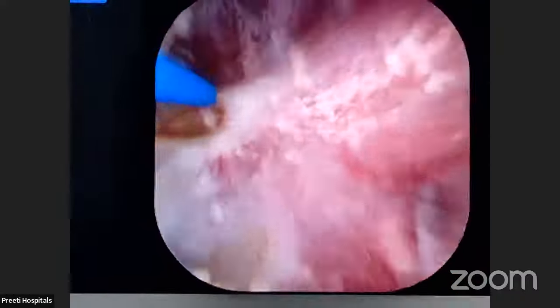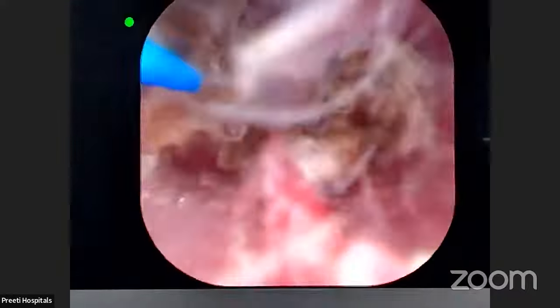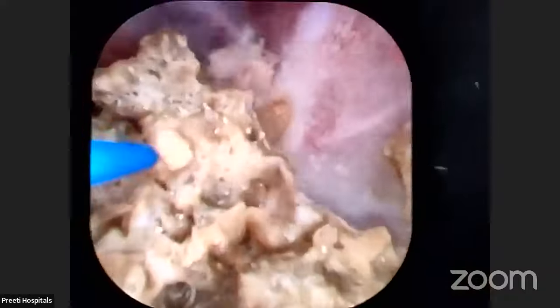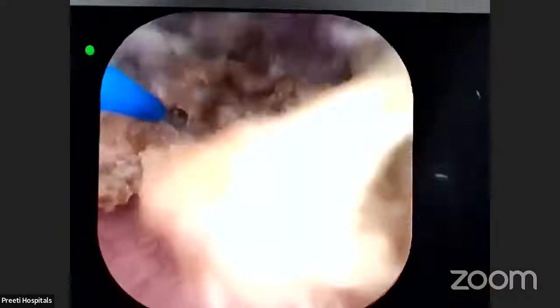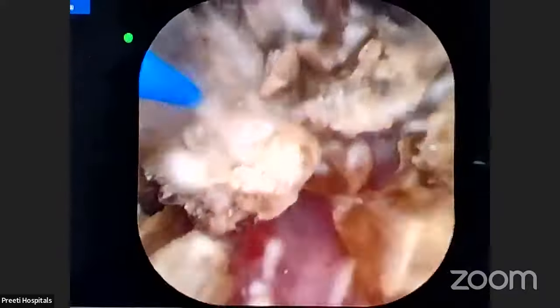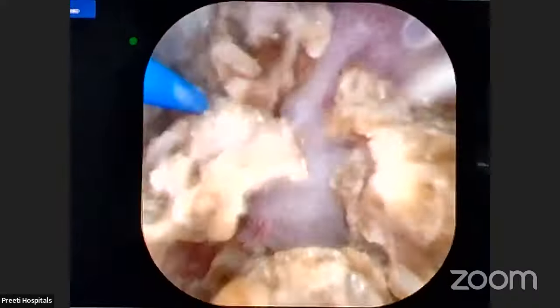But in PCNL, the entire calyx is damaged, torn. Here we are burning only the superficial mucosa. But in PCNL, you will completely tear the calyx, even though it comes from the tip of the calyx. See, purposefully I am making fragments. Why? I can utilize the popcorn method with a little increased frequency.